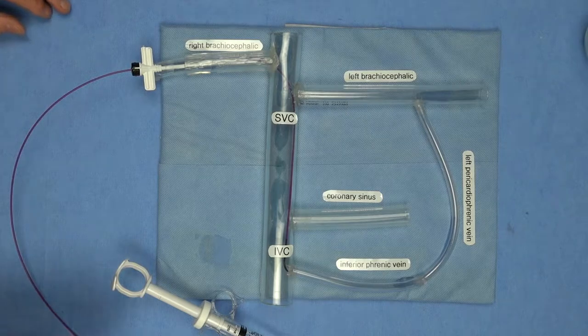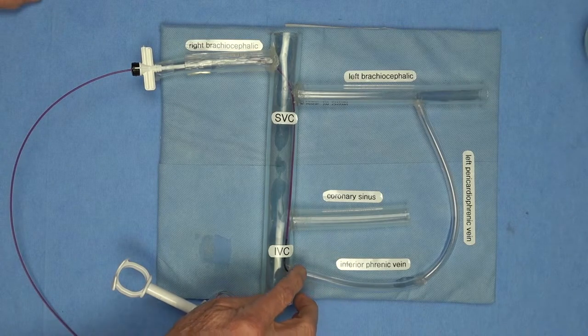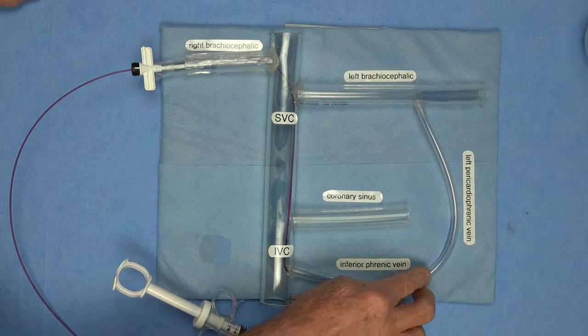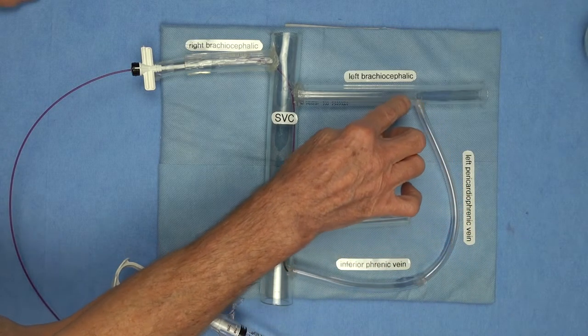And fortunately, it turns out that in many patients, the inferior phrenic vein actually feeds back up into the left pericardiophrenic vein.